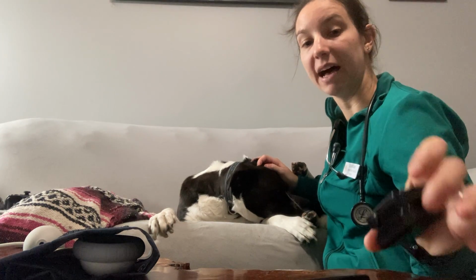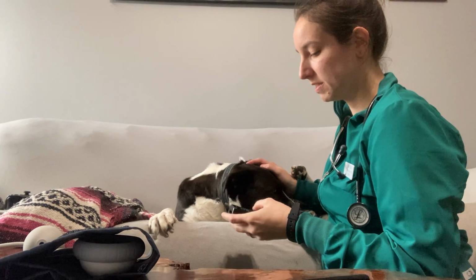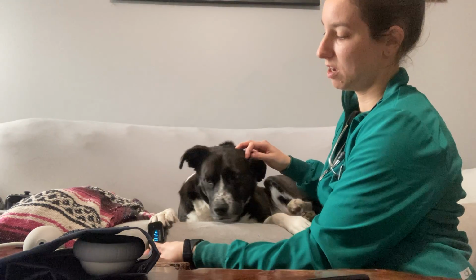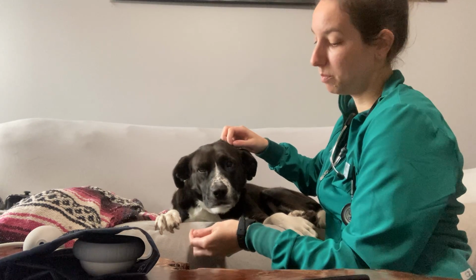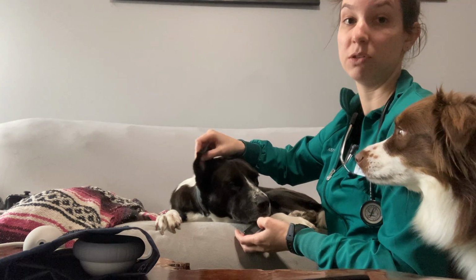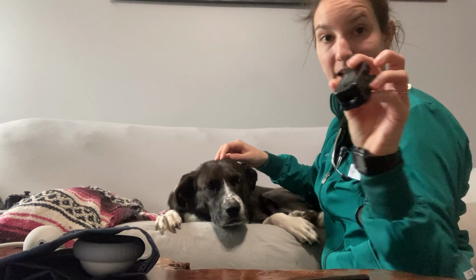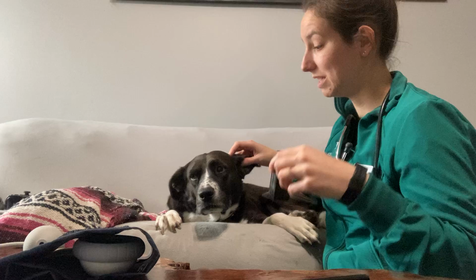I also happen to have a handy-dandy pulse ox. Now, because puppy paws are slightly different than human paws, obviously this is not going to work on a puppy paw. What do you think, Sadie? Now, when we go to the vet, they frequently will use her ears, but they have the little stick-on probes, and they can take her SpO2 measurements off of her ears. This guy is fully intended for a finger and not for an ear.